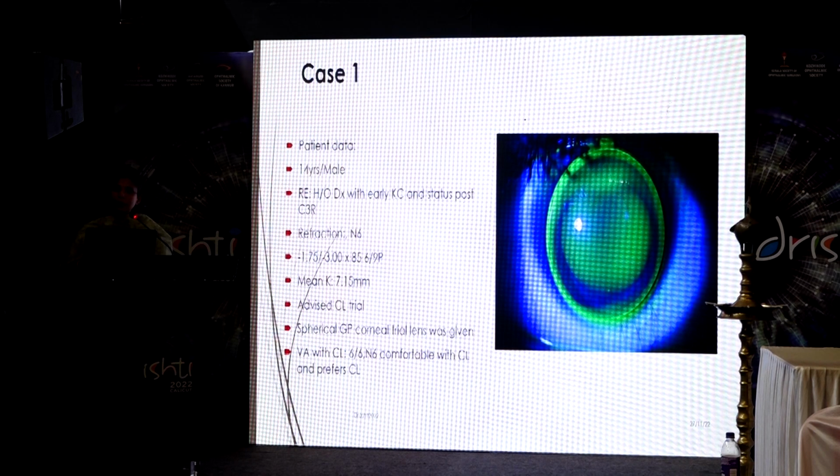You need to maintain the integrity of the cornea. Corneal health is very, very important as practitioners. It's not about improving vision, it's about improving the quality of vision for our patients that we need to look into. Right? So this is just to tell you that not every case requires a scleral lens. That's the reason why I have given this condition, because keratoconus scleral lenses has become a mantra for most of the contact lens practitioners in the country today.